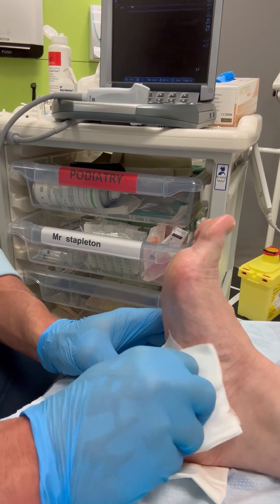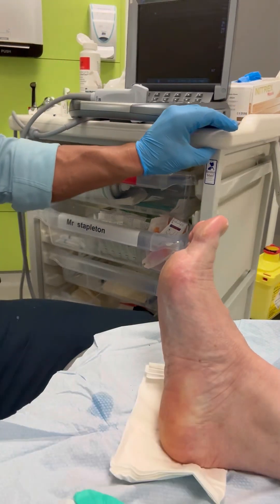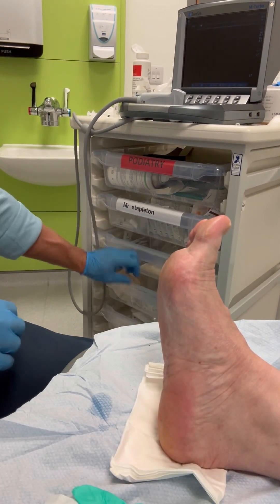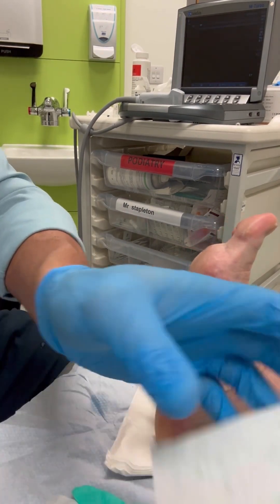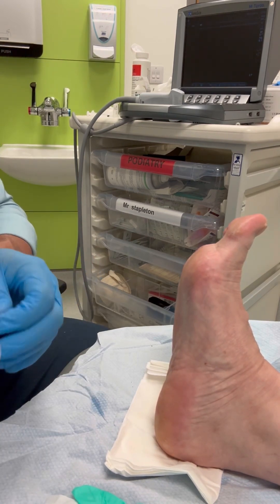This is also almost pain-free, with the vast majority of patients saying the first local anaesthetic injection is slightly more uncomfortable than the second corticosteroid injection. The first injection tends to feel like you've trodden on a wasp — so not overtly painful, but stings slightly.